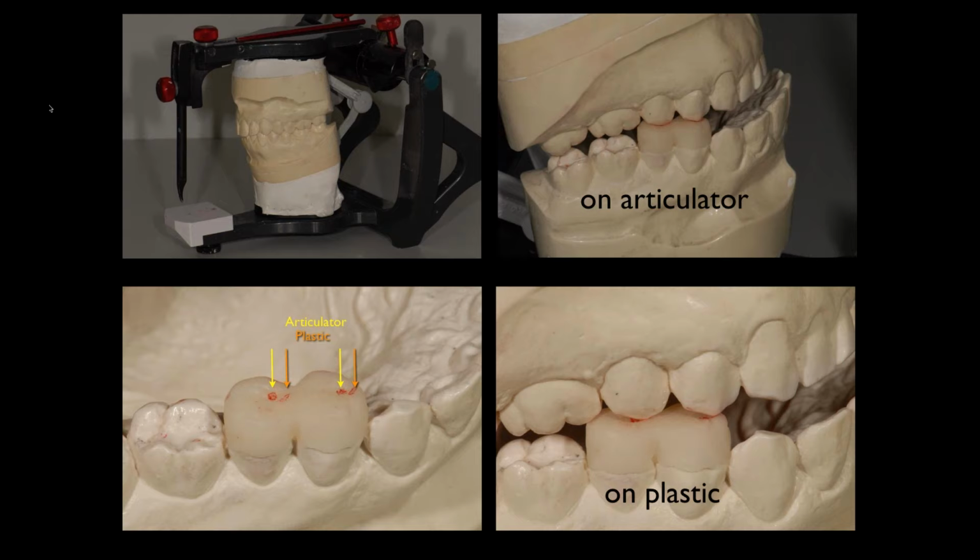And that's because of the way that the hinge axis moves on opening. That's a lot. Now, what you'll see in real life when you open a millimeter or so is not this much, but it's enough to completely screw up your case. Okay, it's a lot of anterior posterior movement of the contact point just because of the arc of closure.